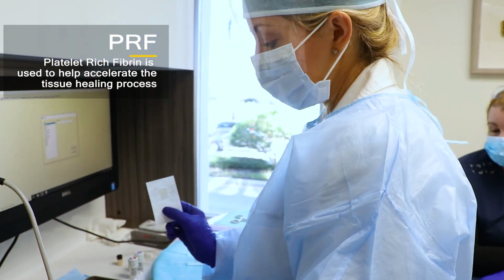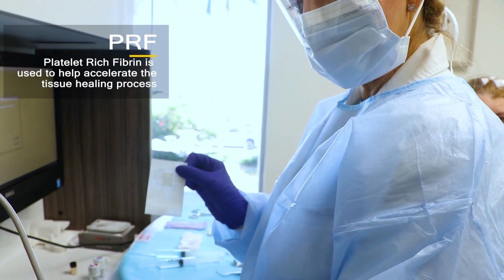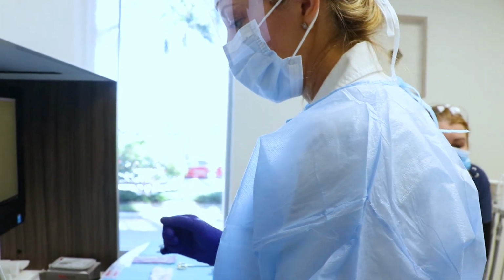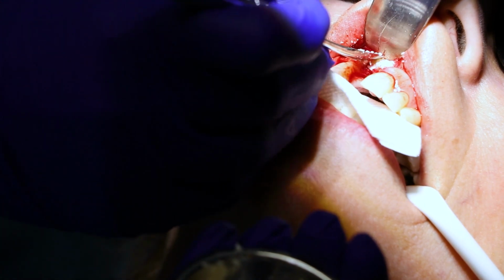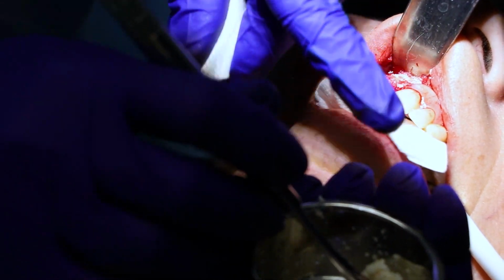And then here I have my membrane, and this is sterile. This is what I will place over the bone graft material so that gingiva or the gums don't invade the space and soften the bone graft material. So you can actually see me placing here the bone graft onto the ridge in the position that I want.